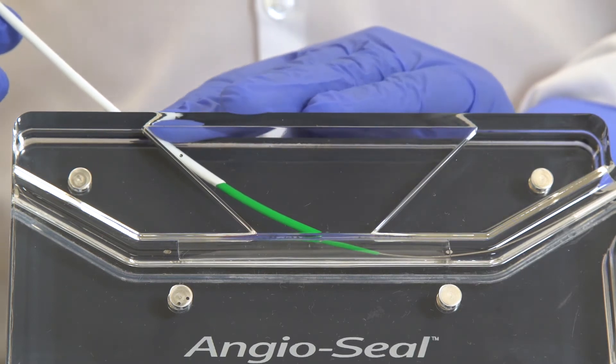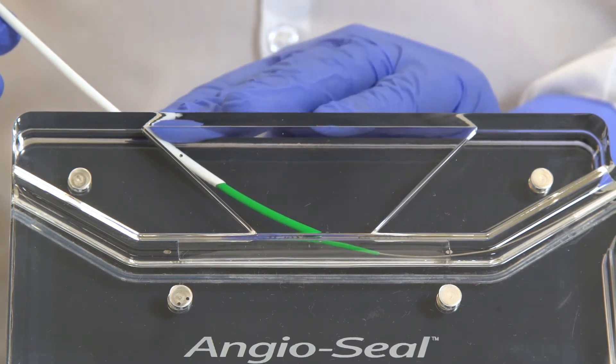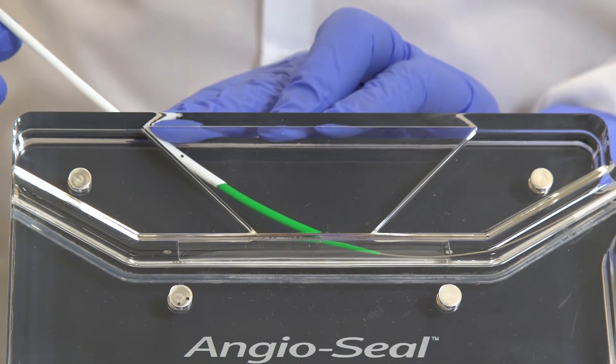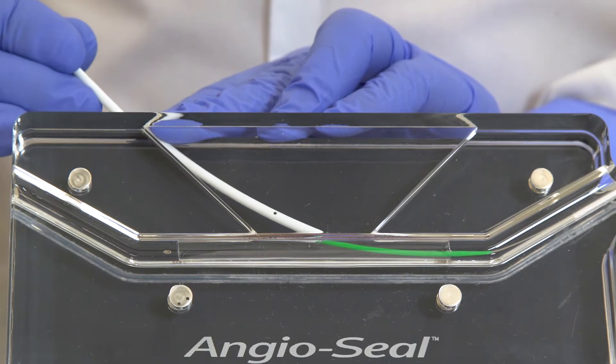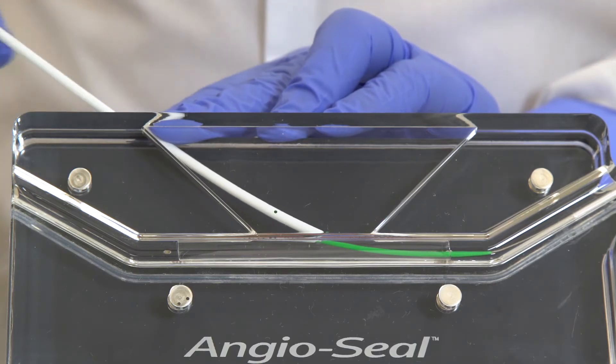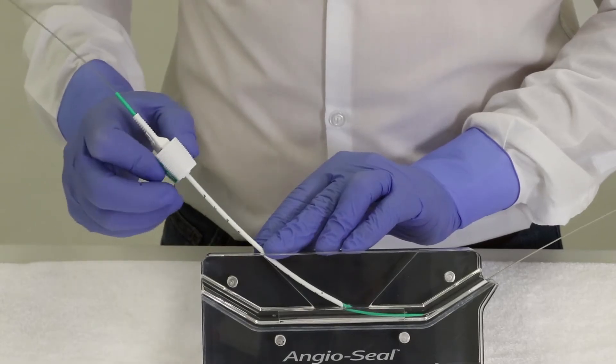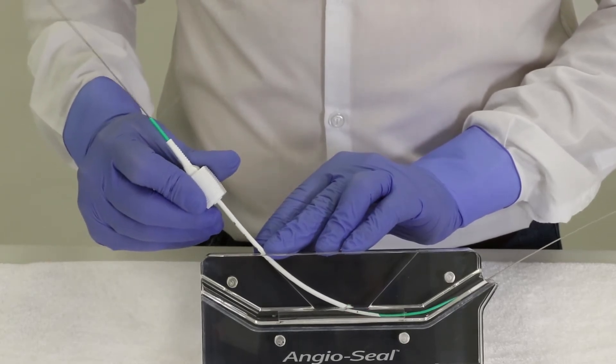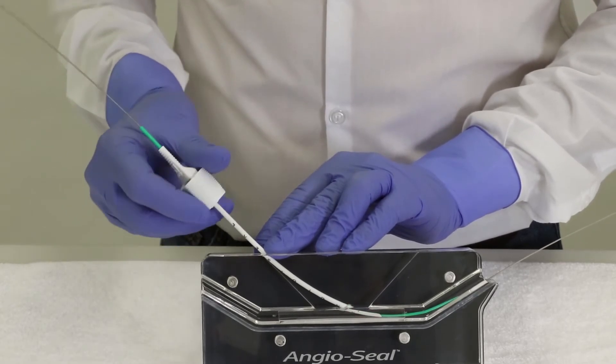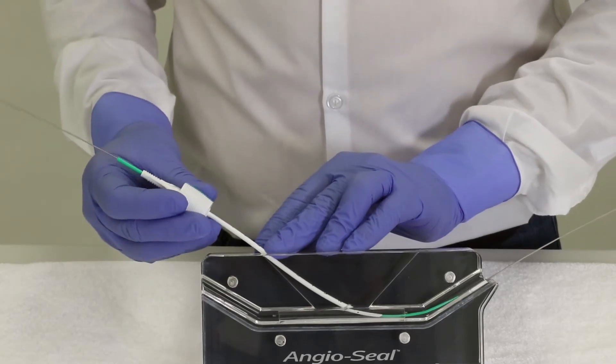Continue holding pressure in an overhand position. Advance your sheath and dilator down into the vessel. If you encounter some resistance, rotate the sheath 90 degrees clockwise and twist it until you don't feel the resistance anymore. Always rotate it up again so that sheath markings and arrow are facing up.